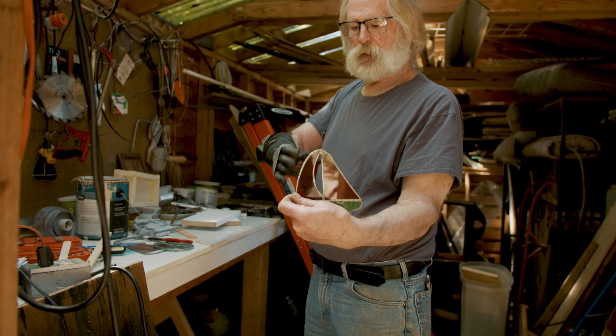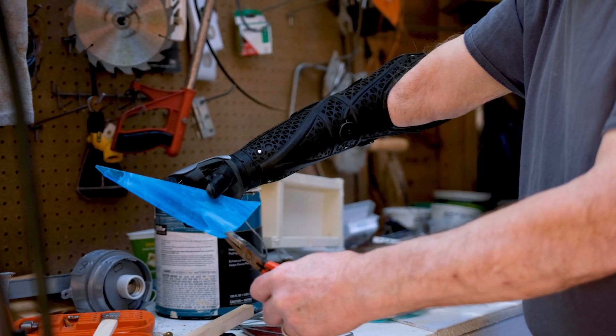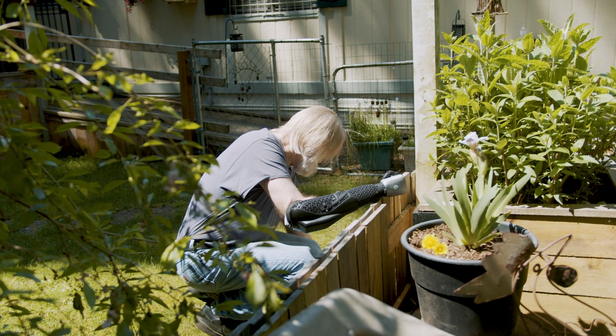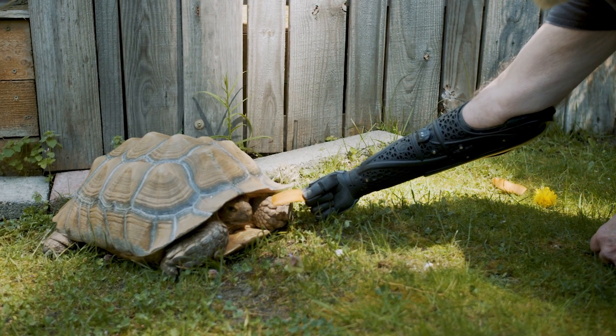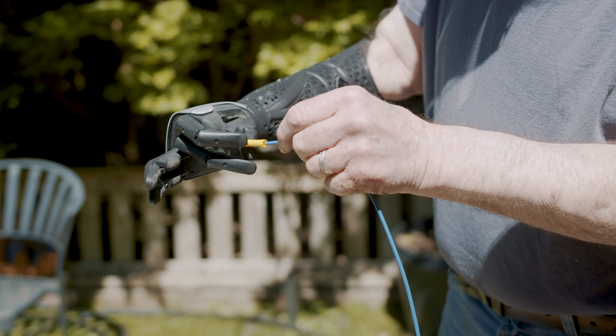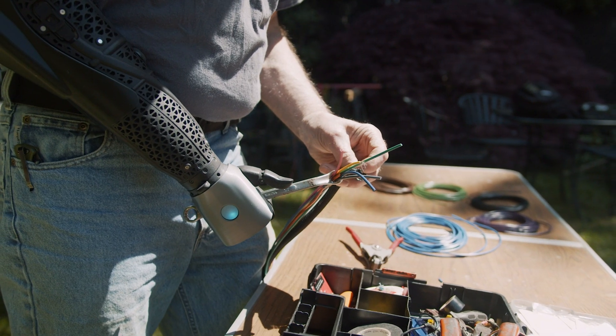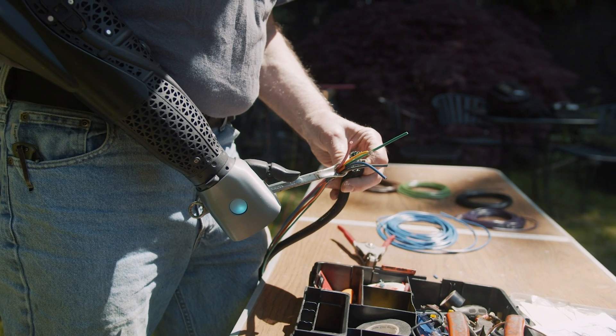I found that I can cut glass with my Hero Arm. I do stained glass work, building birdhouses, building stuff for my lovely wife, turtle enclosures, delicate things like wiring — holding the wire connection, and then putting the wire in there and crimping it. I can do that a lot better with the Hero Arm because it's more a part of me.